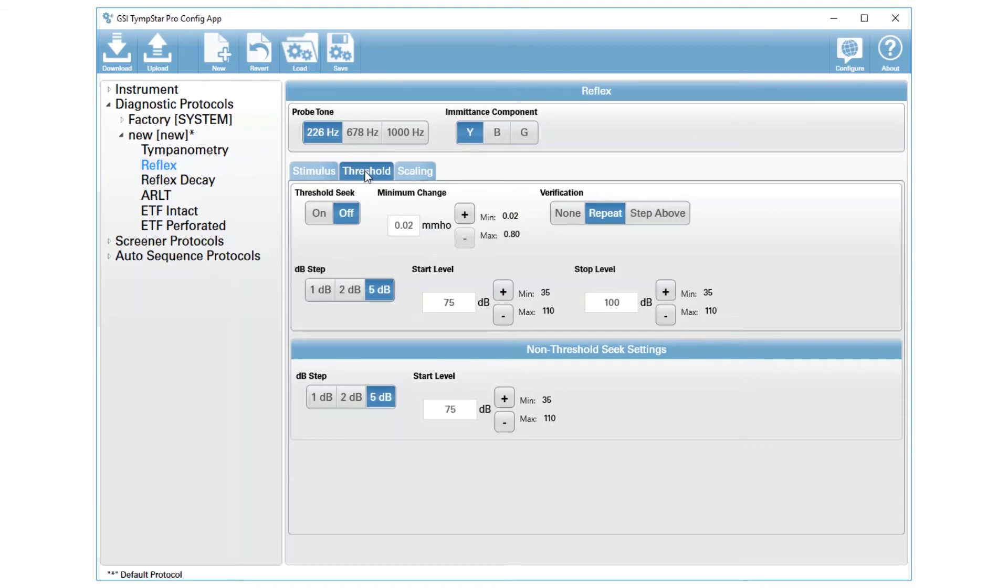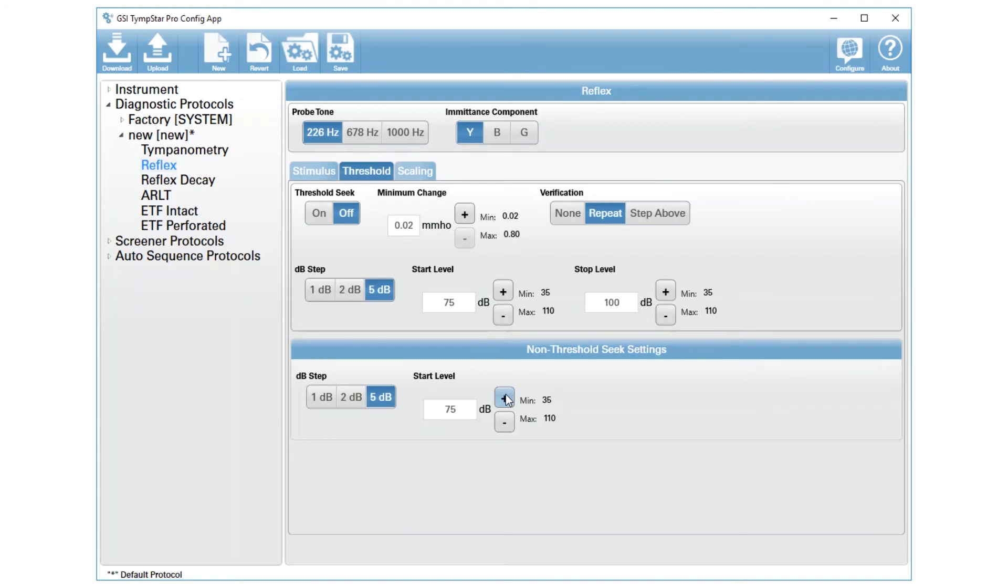You have two options in this reflex threshold to set the start level. Down here at the bottom are your non-threshold seek settings, so this is when you're doing the reflex threshold manually. It is defaulted to start at 75, but we know that sometimes is too quiet. So I will increase my level to 85. If I decide I do want to use that threshold seek, I can change the start level and the stop level to do a more automatic reflex threshold.